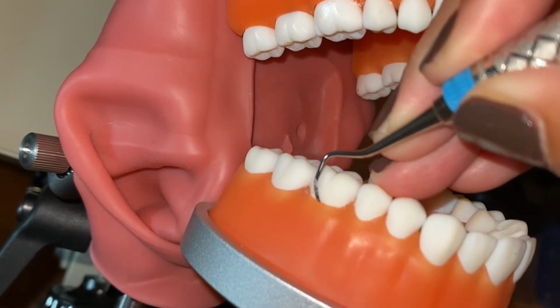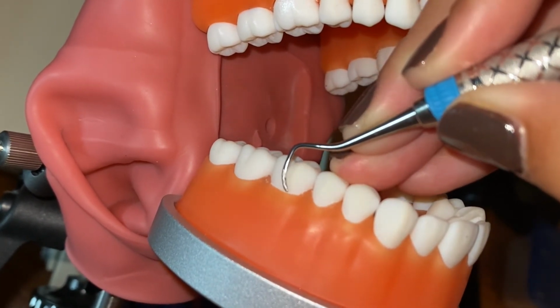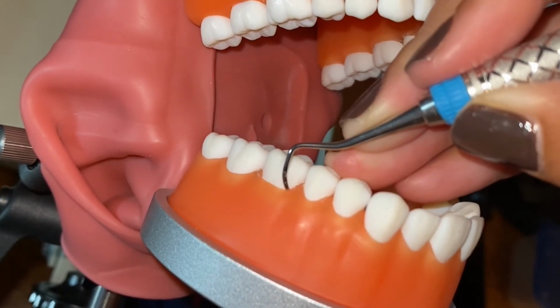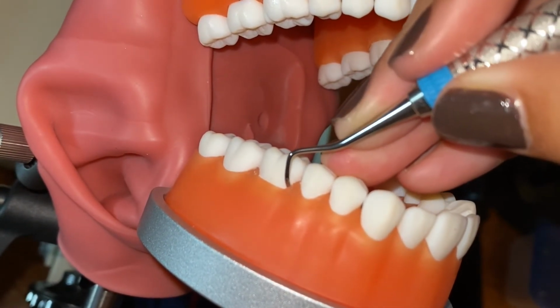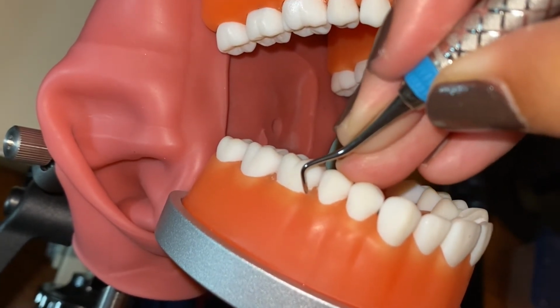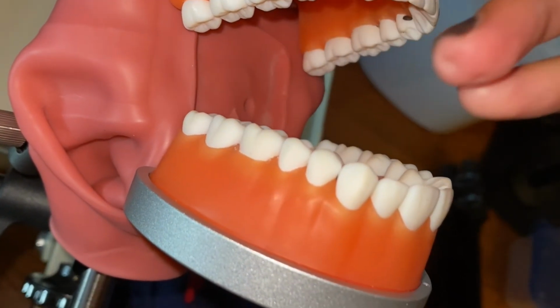And up, down, pivot, roll, up, down, pivot, roll, up, down, and remove.